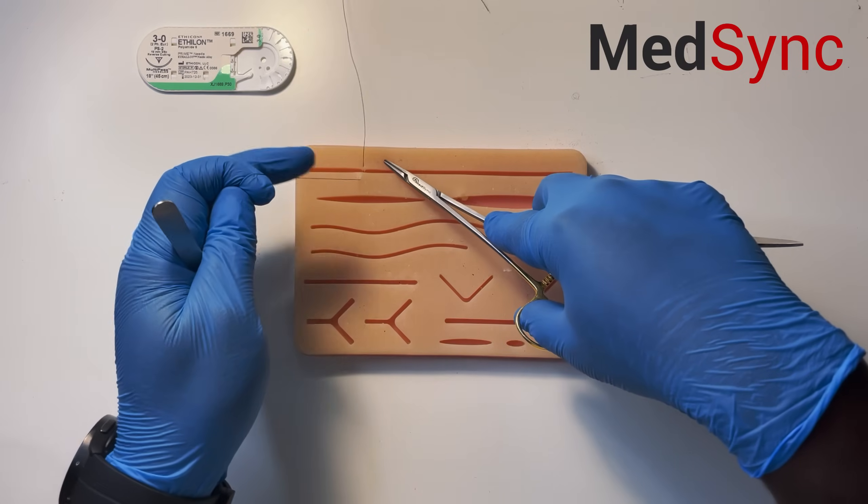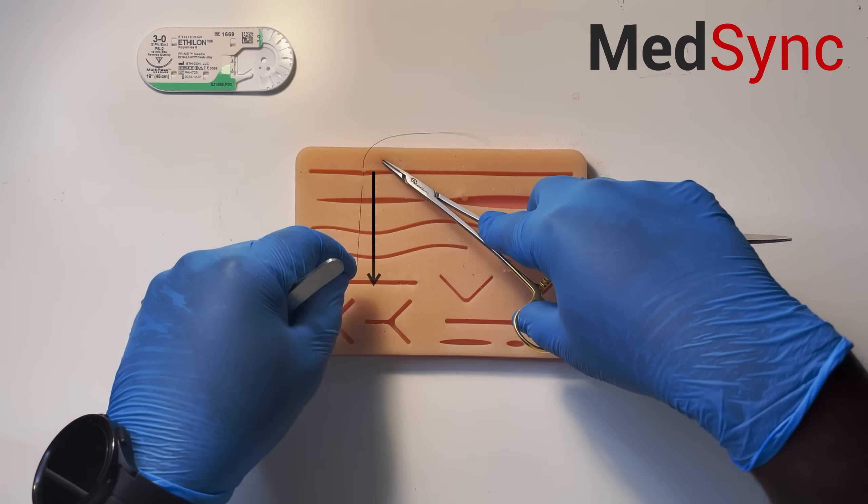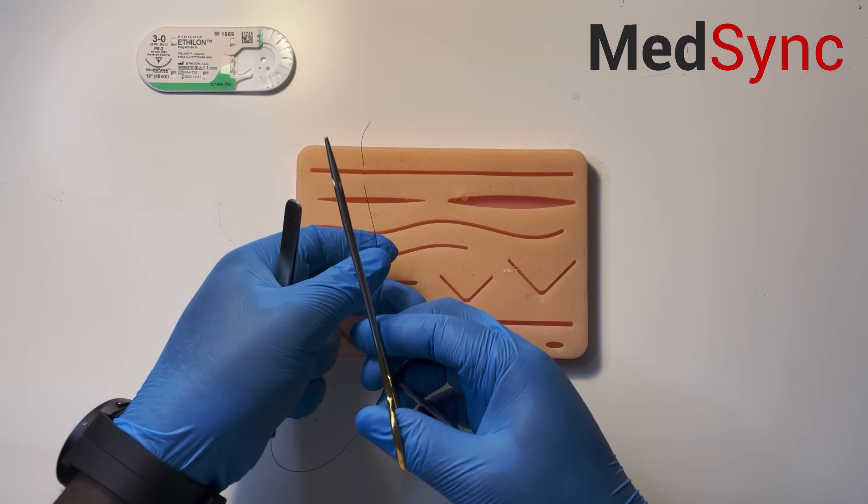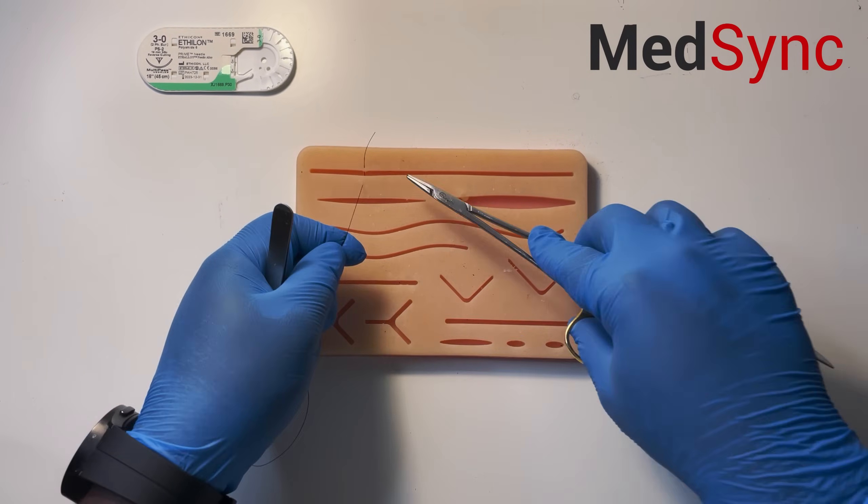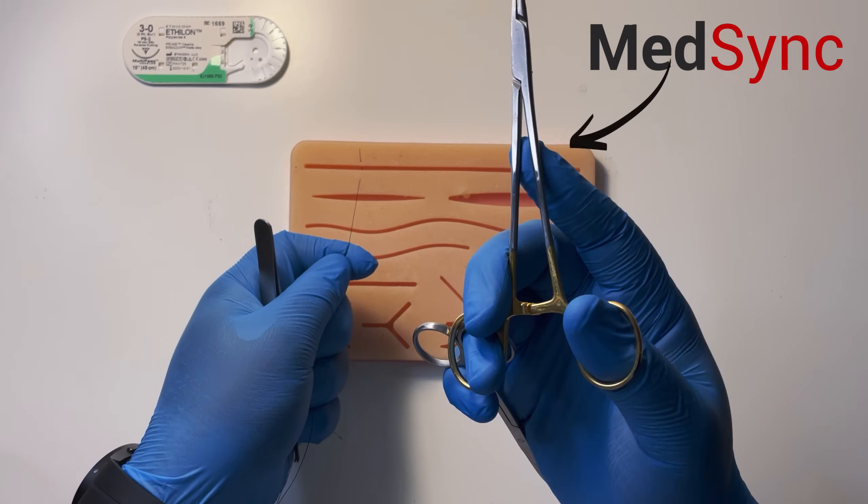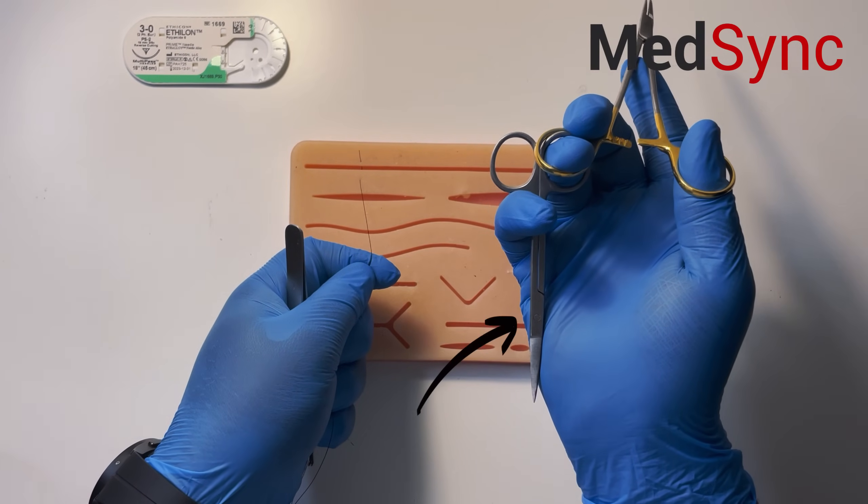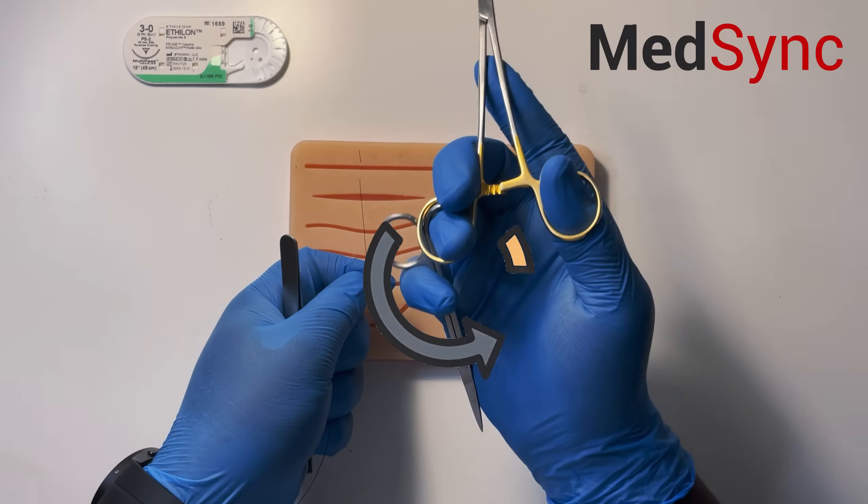You grab the suture and pull it in one hand. This is not tug of war. You don't need to pull it like this. Just pull it in one hand. Your forceps are here, your needle holder is here, and your scissors are here. This is economy of movement.